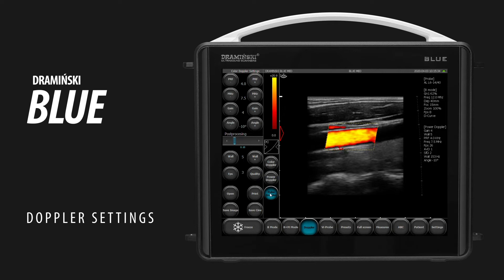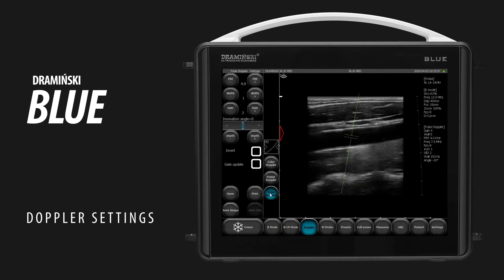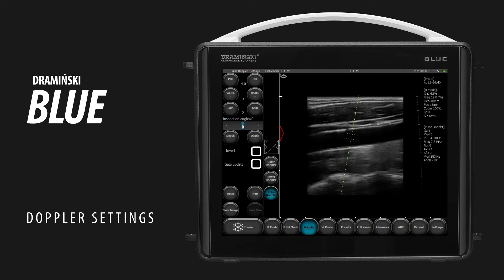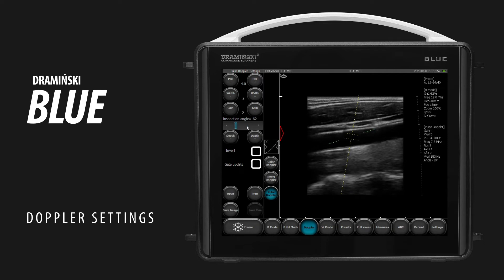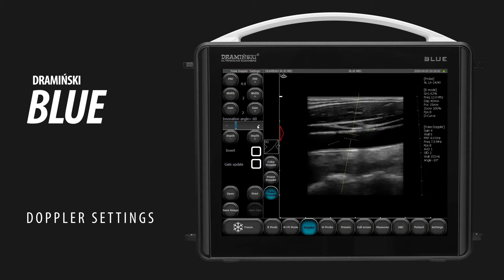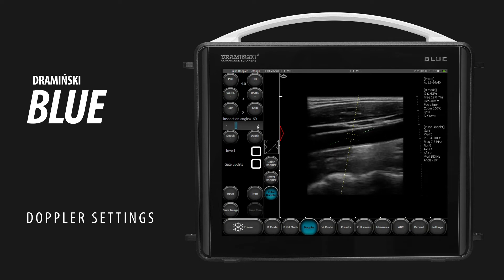Tap Pulse Doppler to turn on Pulse Wave Doppler mode. Adjust the Gate Width if needed. Set the Inclination Angle correction using a slider. Use the Depth buttons to adjust the depth of the gate.